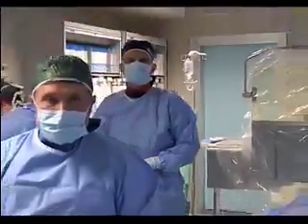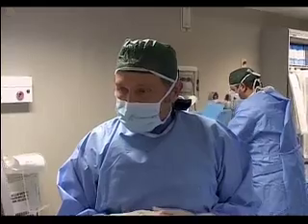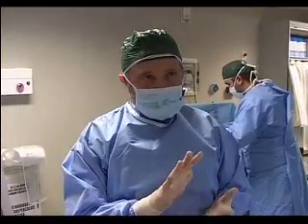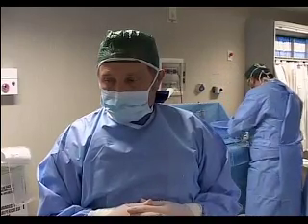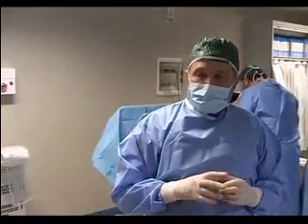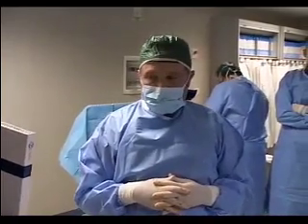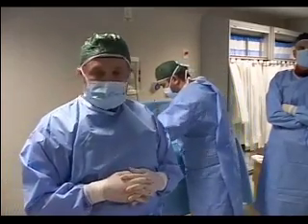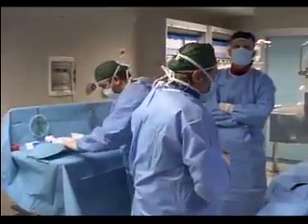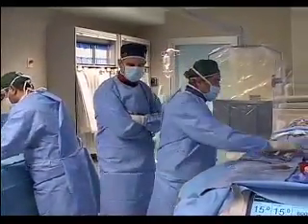The largest ADO2AS is 5. What size are you going to use? Yeah, the largest ADO2AS is 5, yeah? And the length I'm going to use is 6 millimeters. So let's try. I wouldn't bother, Mario. Yeah? I wouldn't bother. It's just going to pull through.